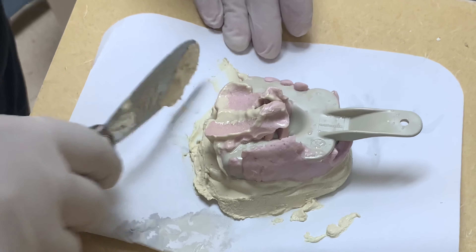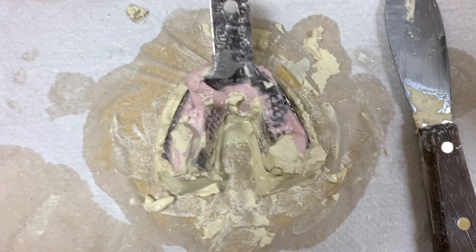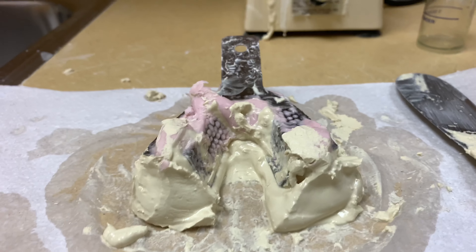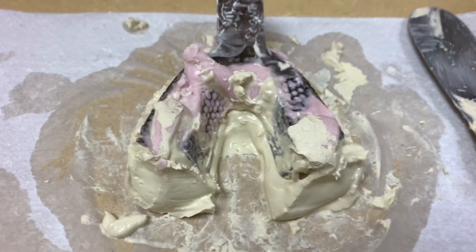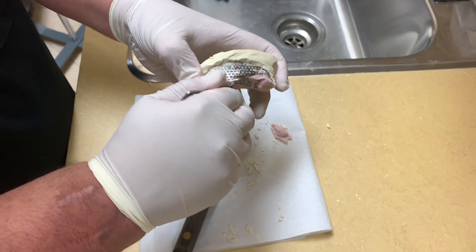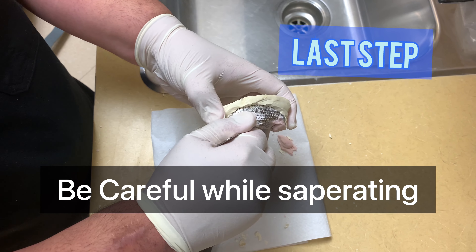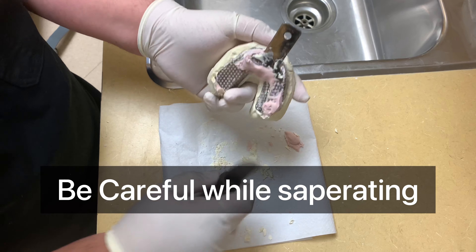Press and remove the excess stone using the spatula. This is how the maxillary cast looks, and this one is the mandibular cast. We remove the excess material so it's easy to separate when it's dry. Wait for one hour — meanwhile, clean the area.